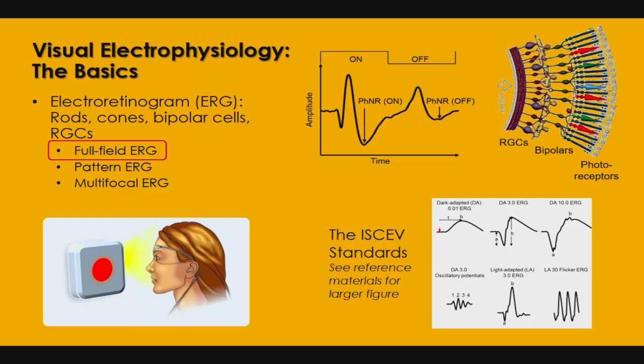Okay. So, as I indicated, the ERG, which has to do with the retinal function, comes in 3 flavors. So we have the full field ERG, where you are trying to get the overall function of the entire retina. You might come across the word Ganzfeld, or Ganzfeld bowl. It is just German for the whole field. English people like borrowing other people's language, so you'll find it in textbooks as the Ganzfeld ERG, but it just means full field ERG.